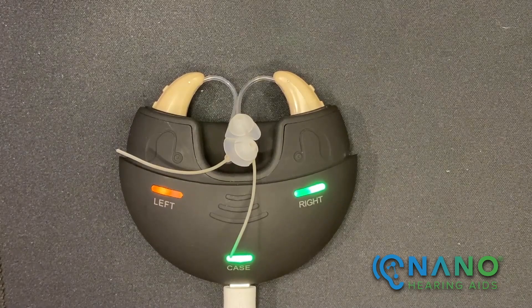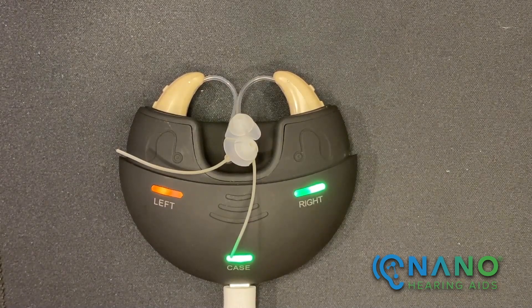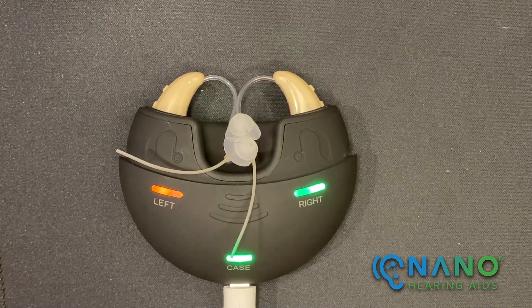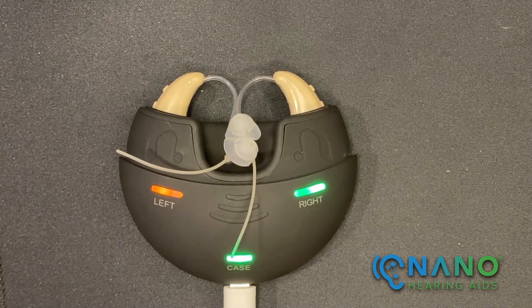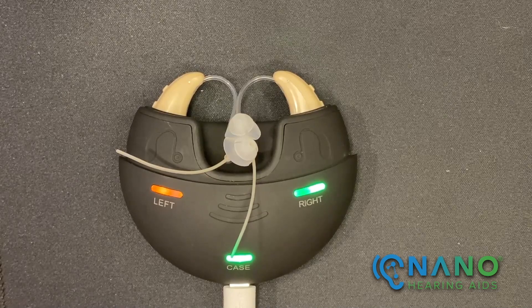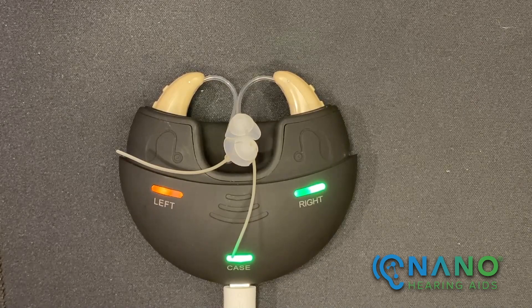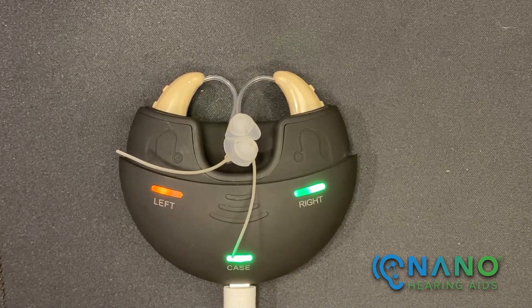I'd like to provide a few tips about charging and the charging case. We recommend leaving the hearing aids in the charging case any time the hearing aids are not in use. The hearing aids should be turned off prior to charging — if they're not turned off, they may not properly charge.